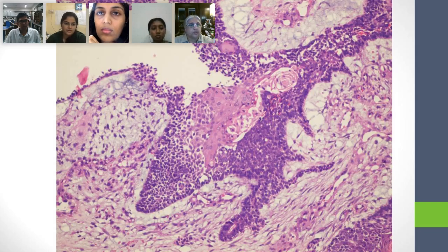You've got your pointer, no? Show me the adjacent normal cells and tell me which has become more, because you're saying that there is hyperchromasia. Ma'am, this part which I have drawn, this epithelium, shows normal maturation. The cells are aligned properly, but in this particular part the cells are crowded with more blue-looking enlarged nuclei, and they seem to come down into the stroma.